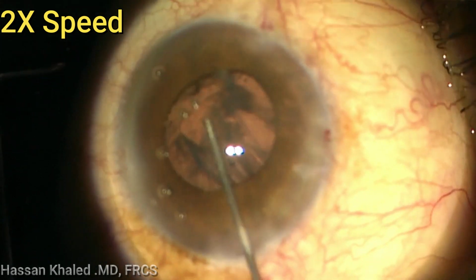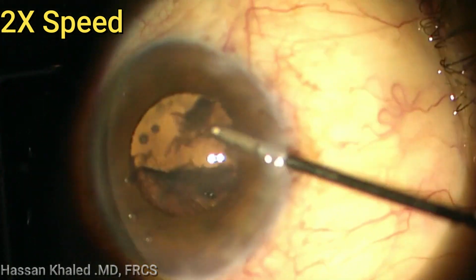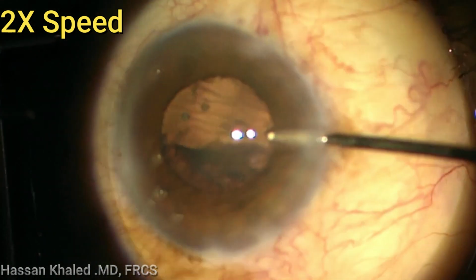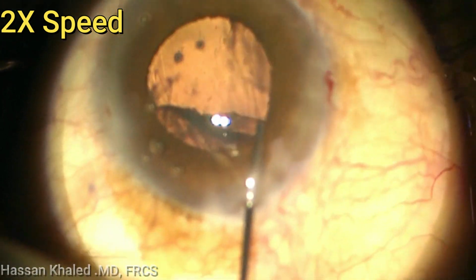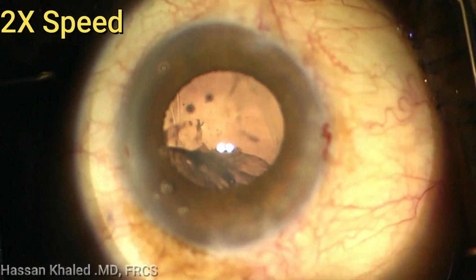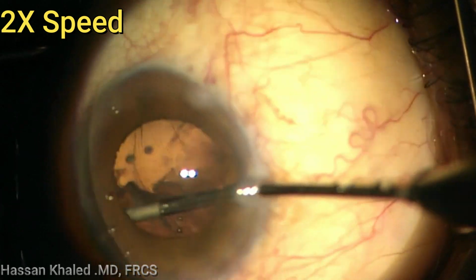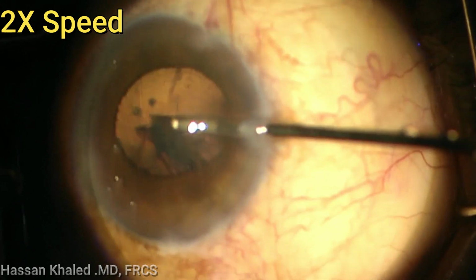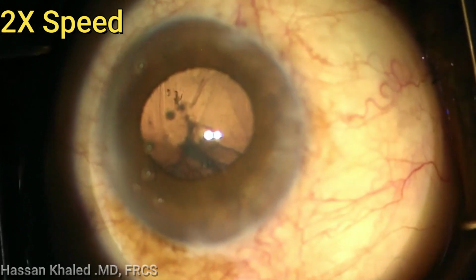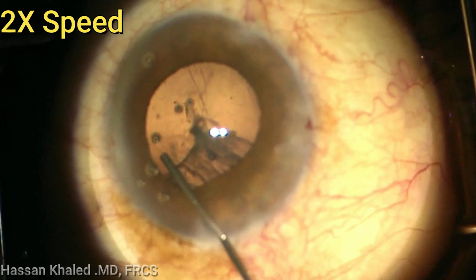This step actually needs time to remove the cortex using the dry cortical removal with the aspiration probe, and it's a crucial step to re-inject a dispersive OVD many times to prevent the vitreous prolapse into the anterior chamber. You can see here injecting the dispersive.